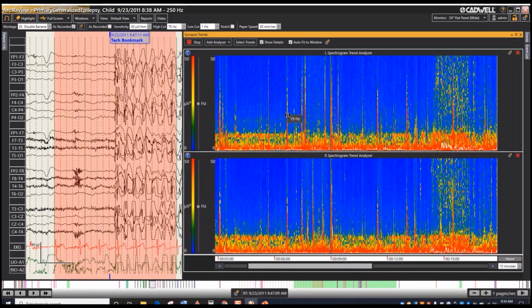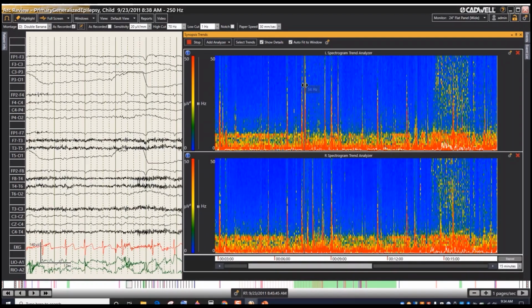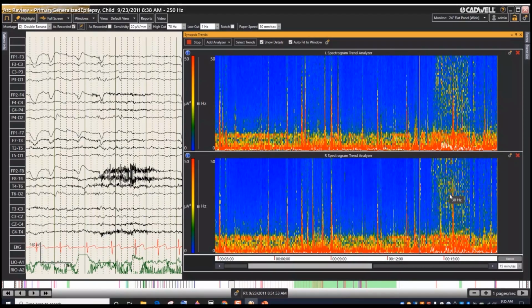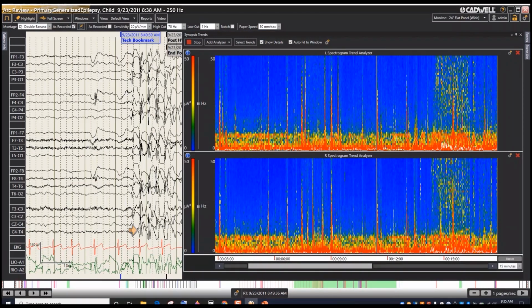Actually, there's a few other peaks as well. You notice it's not the same appearance that we see in some other peaks. For instance, this peak doesn't have that nice stripe, and that's artifact. So when we see that striping, at least for this patient, we can make a reasonably good judgment that there's seizure activity. You'll notice this striping in this activity is very much different than the appearance of these others. Now this may be an imperfect tool, but again, the intent of this is to draw your attention to specific segments, and it does that quite well.